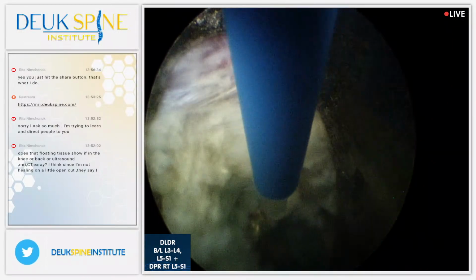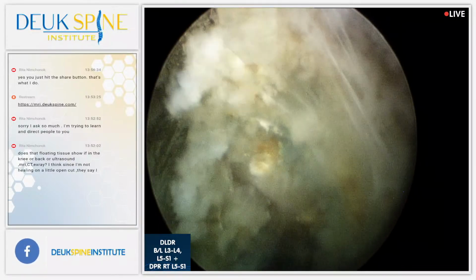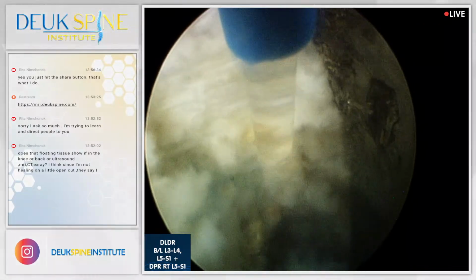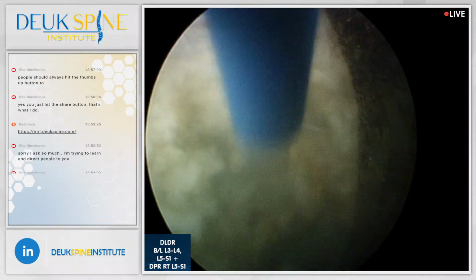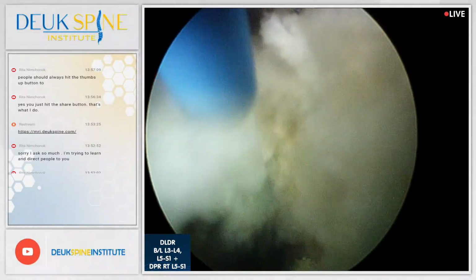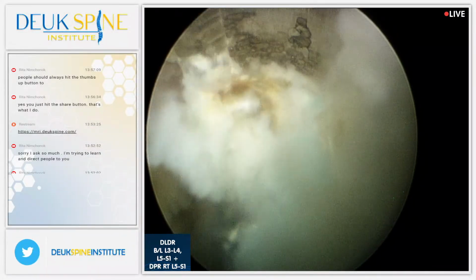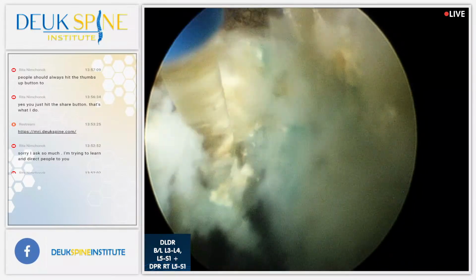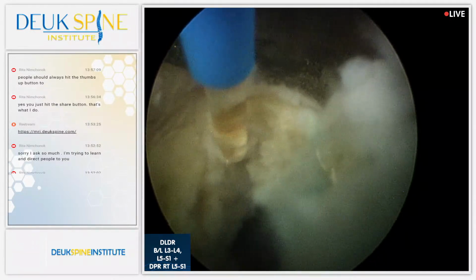All right, any other questions? Next question coming from Rita, once more on YouTube. By the way, we're at the end of the disc, at the end of the tear, at the end of the herniation. We started on the inside. It's called the inside-out technique. It was developed by Dr. Anthony Young. He was one of my teachers, and taught me this technique with the endoscope, not with the laser. Dr. Young believes in the inside-out technique because it's safer, and I find it to be the best technique. There was a lot of herniation here, and we're almost done. All this stuff was pinching on his nerves, causing his leg symptoms. I think his leg symptoms will be gone now.